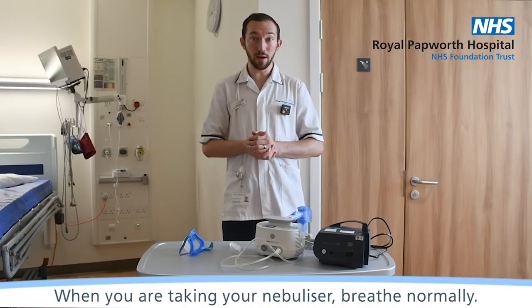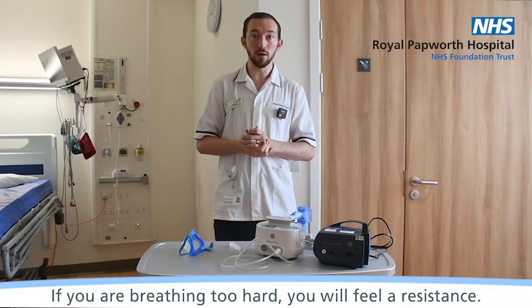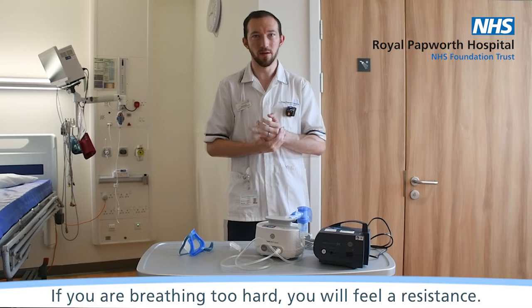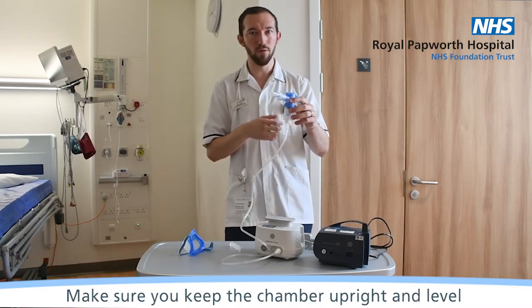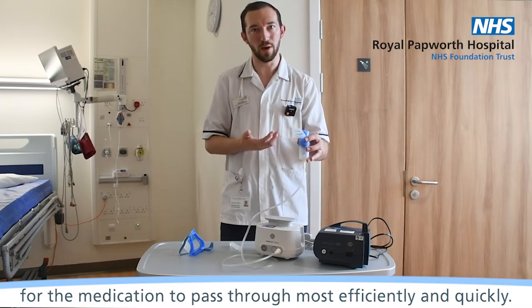When you're taking your nebuliser, breathe normally. If you're breathing too hard you'll feel a resistance. Make sure you keep the chamber upright and level for the medication to pass through most efficiently and quickly.